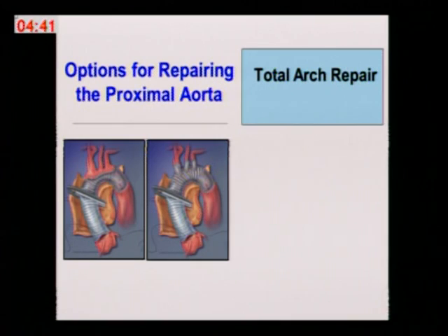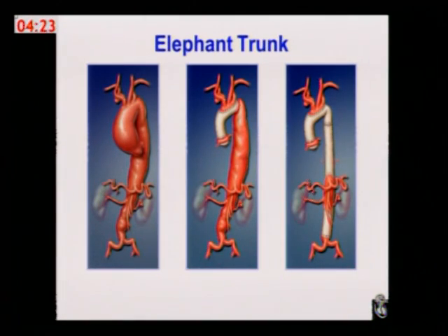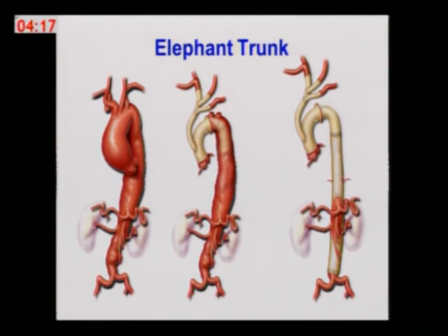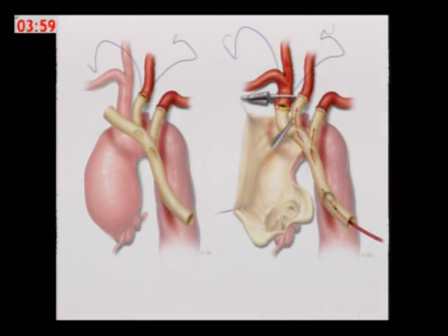In the total transverse aortic arch, we've got the traditional patch repair of attaching the brachiocephalic vessels, or the branch open repair popularized by our colleagues in Japan, to now more frequently a multi-branch approach, really pioneered by the group out of Mount Sinai. And of course, for total aortic replacement, there's always been the open elephant trunk. The evolution of aortic arch repair has not stood still.